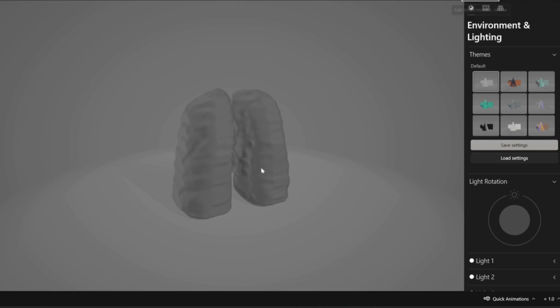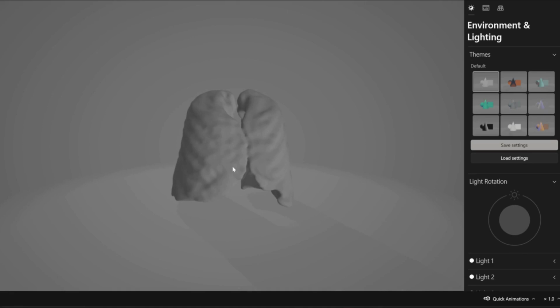And something that I didn't mention is that I am putting a self-clean system in the server. So each hour, any files in the backend will be deleted. So no one has access to your files, only me, but I don't even access them, because most of the time they are deleted before I can see them, and for sure I don't need to, and I will not see your files. But you can always ask me about that, whenever you want.